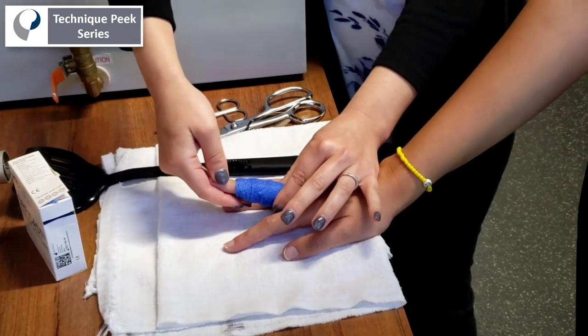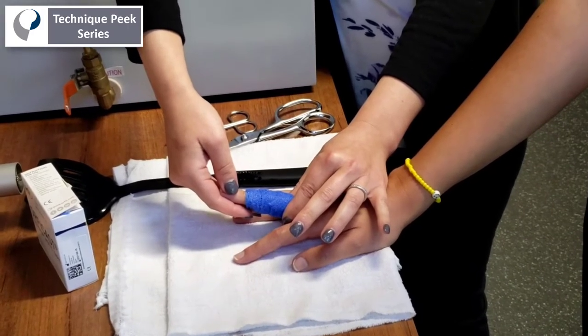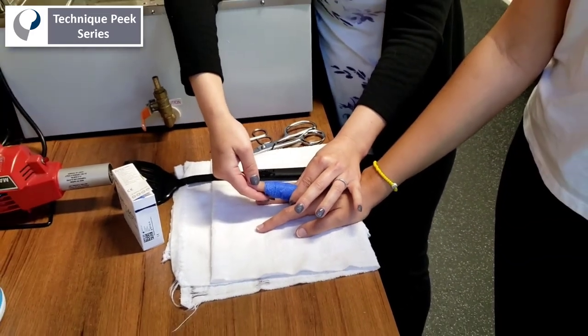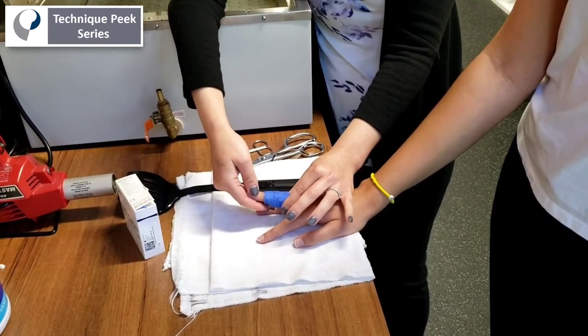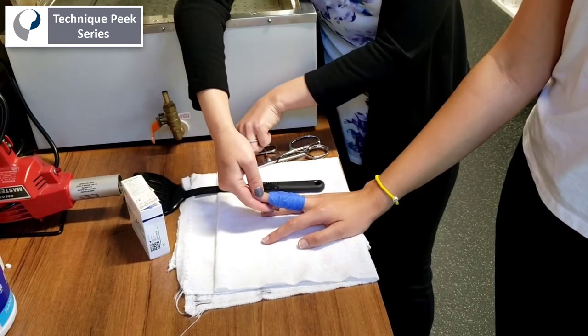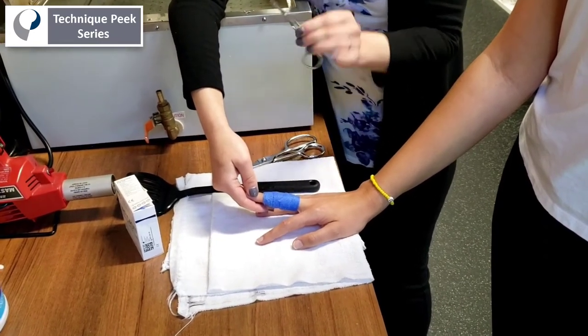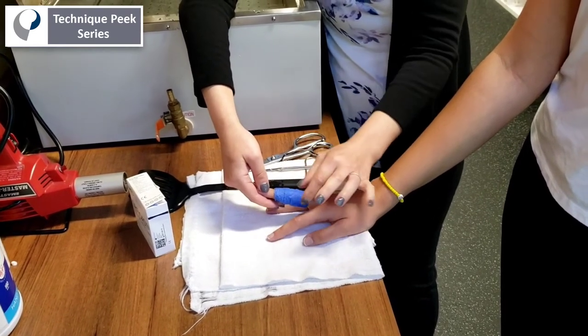As mentioned, you're usually keeping this on full-time in between the changes of the cast. But if a patient does need to remove it, most of the time this cast can be slipped on and off. And if it needs to be removed urgently or if it's a little too tight for that, you can just use a pair of protective scissors from a suture removal kit and cut your way up the side.